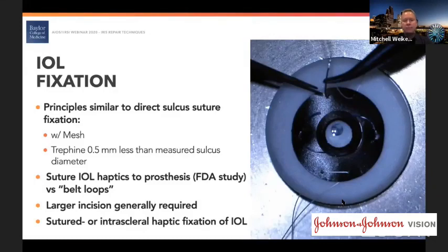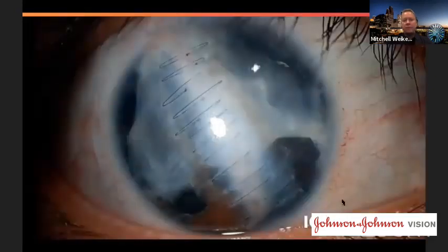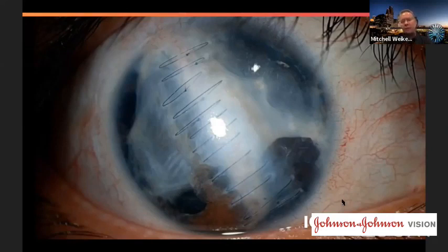So this is a case of a traumatic open globe injury that was repaired elsewhere. You can see they got a good repair of the cornea, lots of sutures around the cornea, a lot of scarring here. And you can see some underneath there, especially inferiorly, we've lost a lot of iris architecture. So we're going to do a PK here. We're going to implant this open sky, so we're going to have a very large opening with which to do it.